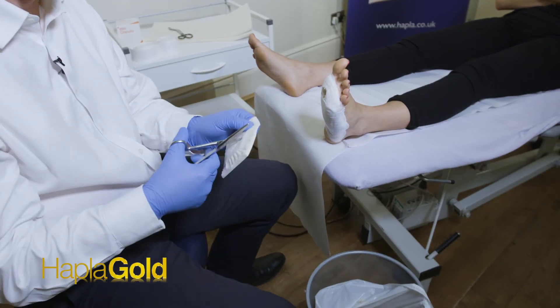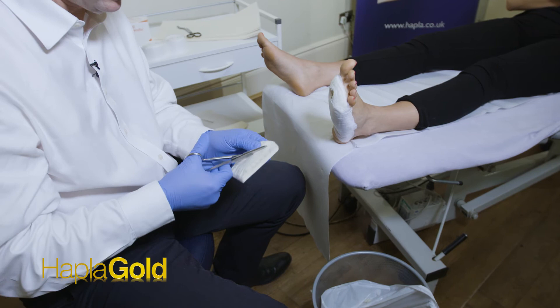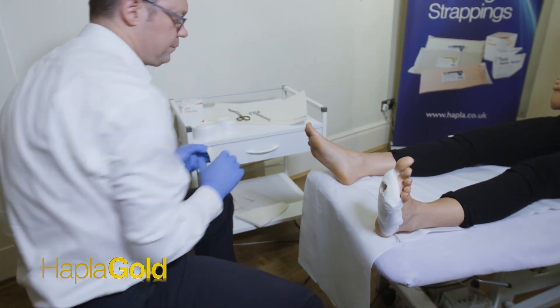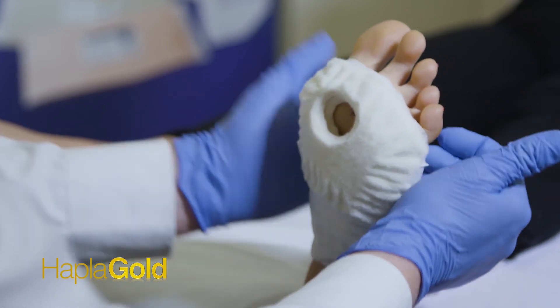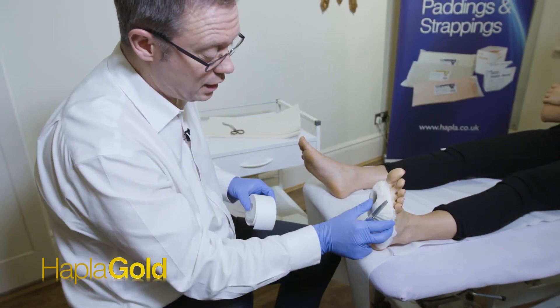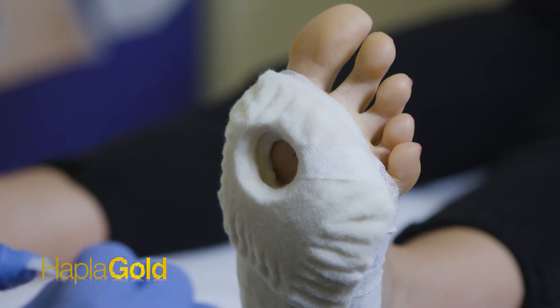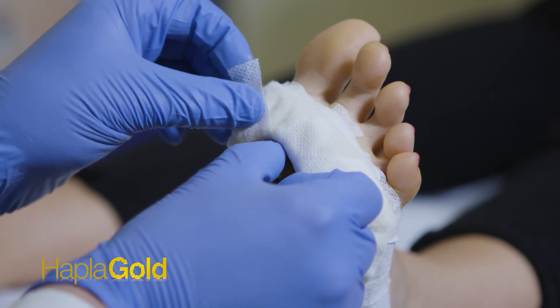Our aperture is sighted so it will overlie the previous pad's aperture; we cut round with a similar exposure. We peel off the paper back and stick down. Before we apply the retentive strapping, we're going to ensure that the aperture remains wide and open. We do this by using some small strips of retentive strapping placed around the aperture to make sure that the felt fibres don't touch the wound surface.